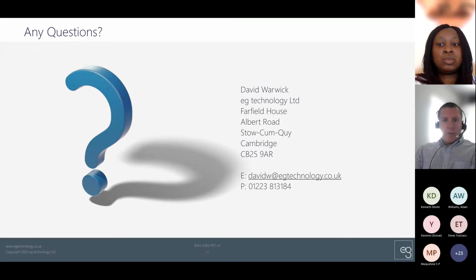So it's about how you're documenting your development and how it's designed, and then I think you extend that into your expectations for the system and how you are going to control the risks of undesirable changes. How are you going to know if your system has gone off and trained in completely the wrong direction? How does it self-update, or do you have a rolling program of updates where maybe you gather data every 6 months and then there's an update to the system? All of these sorts of things need to be thought about.